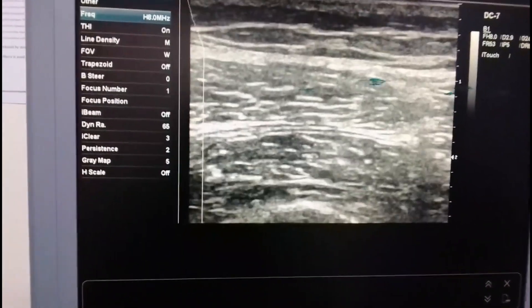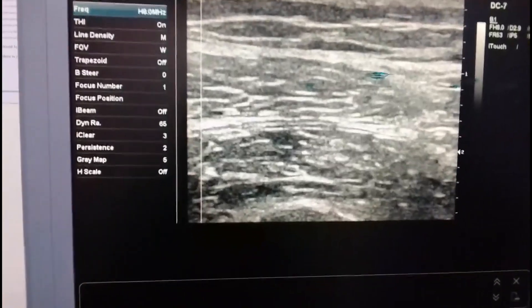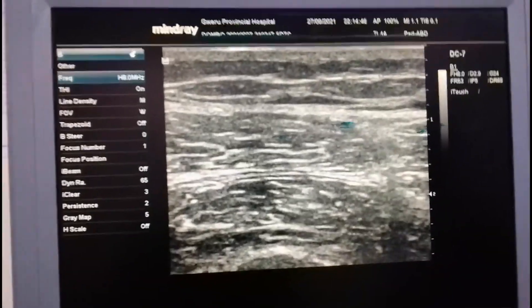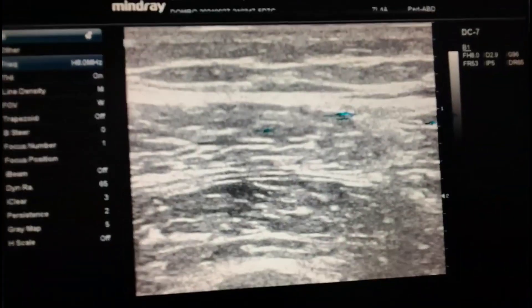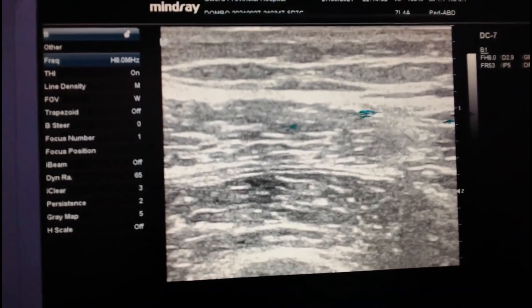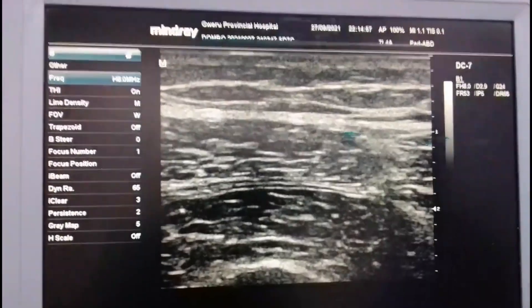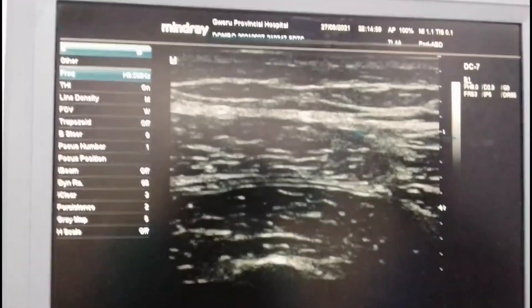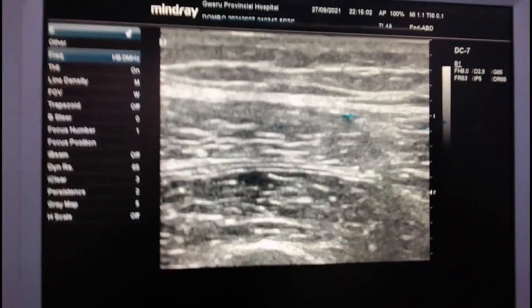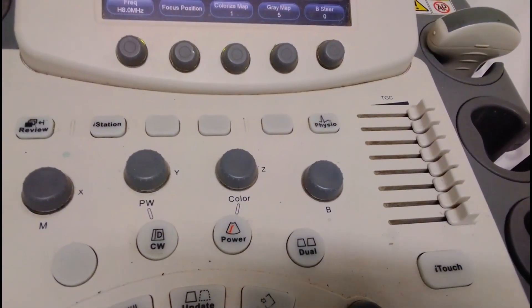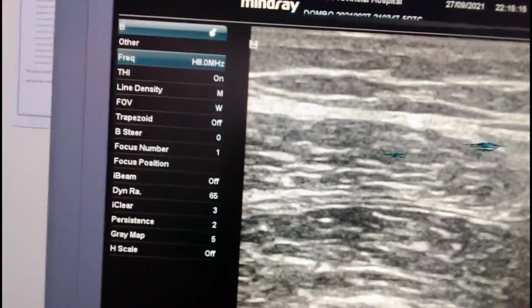The problem is you are going to create an artificial pathology that actually does not exist. So this is exactly what we need to avoid. When you use time gain compensation and try to align correctly, the image is just coming better and you can actually adjust other parameters like the brightness and the overall gain — I am going to talk about the overall gain as well.